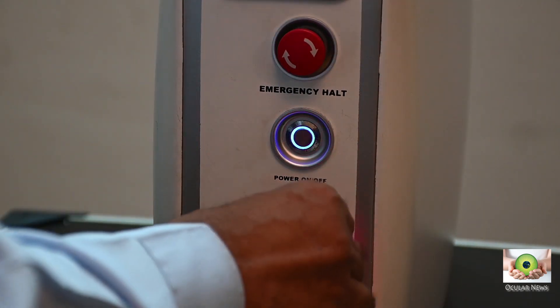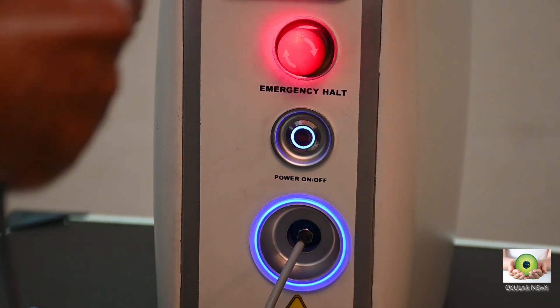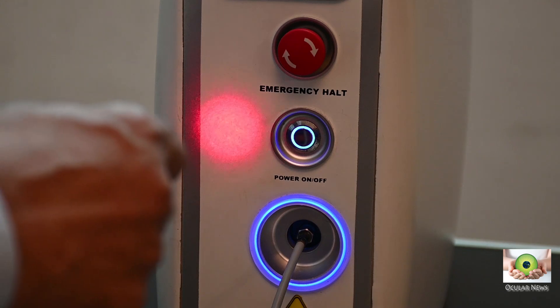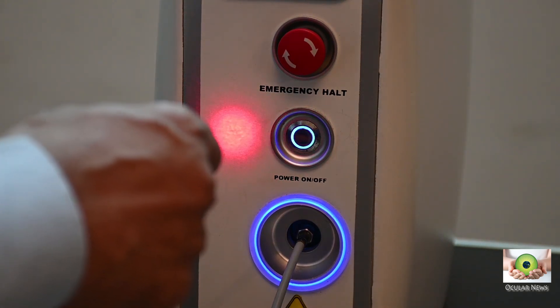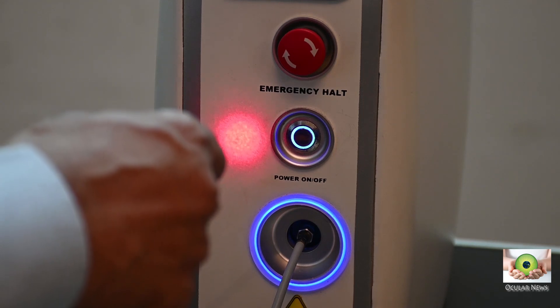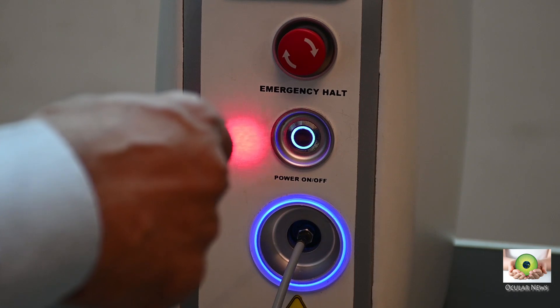Though Appasami has said that using a non-proprietary cable will change the actual spot size in reference to the spot size displayed on the slit lamp, because the doctor always treats by looking at the spot size on the retina rather than by what is displayed on the console, whether this is going to be of any clinical significance to you or not, you have to be the judge of that.